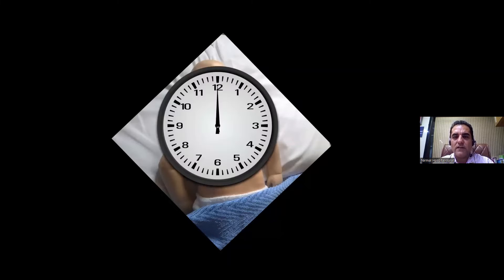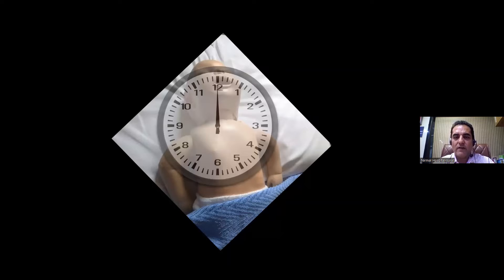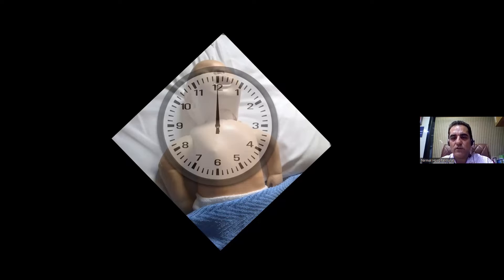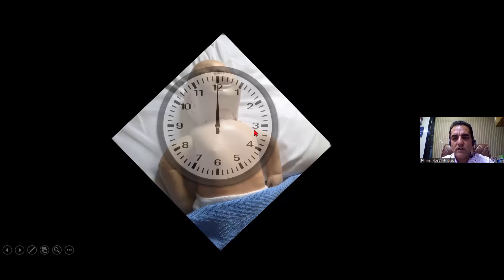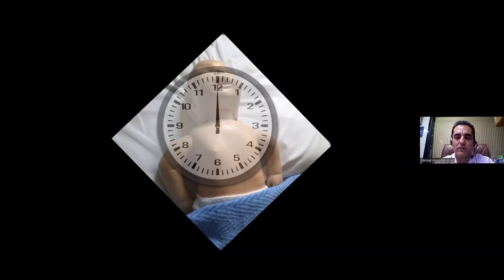It is always a good practice to imagine a clock in front of the baby. Because otherwise, the probe orientation marker will remain fixed on the left side of the echo screen — what rotates or moves is your probe. It is very difficult to remember that the probe is facing right shoulder, right foot, or left shoulder, so we always think in terms of a clock: towards the head side is 12 o'clock, towards the foot is 6 o'clock, towards the left side is 3 o'clock, towards the right side is 9 o'clock. This makes it easy to communicate where the probe marker is facing.